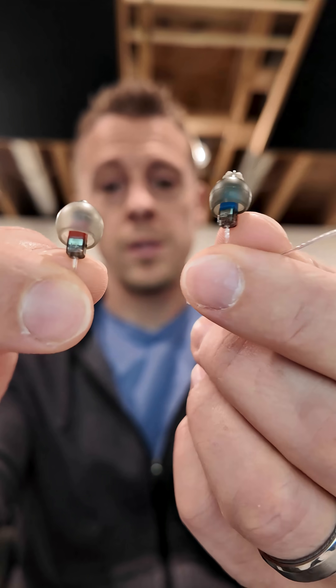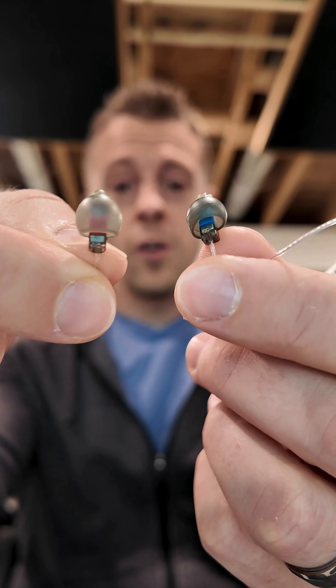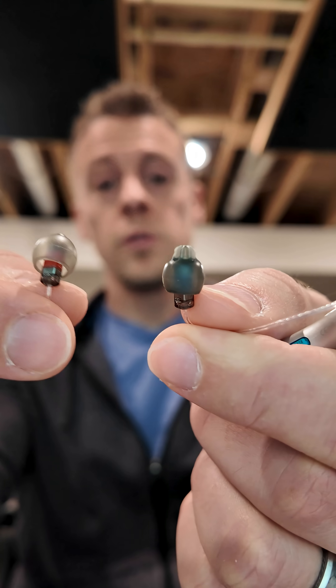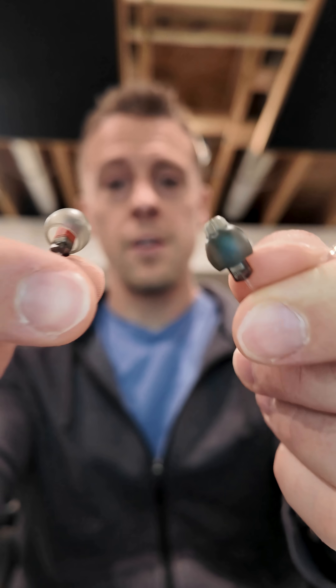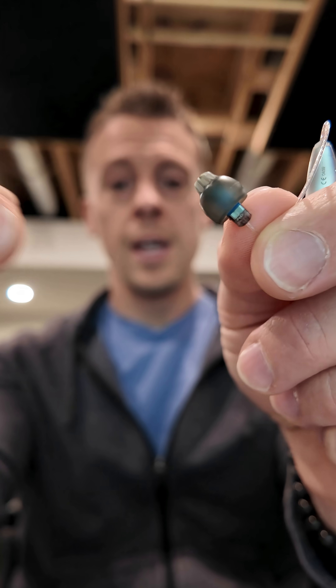I quickly wanted to show you one new product that Phonak has released, and that is their new ear tips. On my right here, you can see the previous vented closed dome, and on the left here is the new ear tip that they've designed. I don't know if you can really see it in the video, but there is kind of this more protruding tip that didn't exist on the previous one.